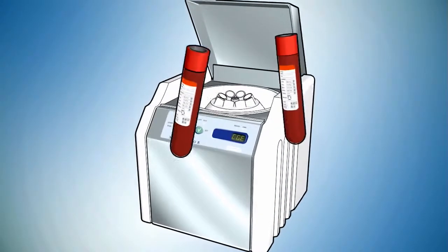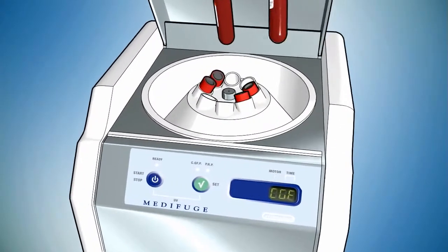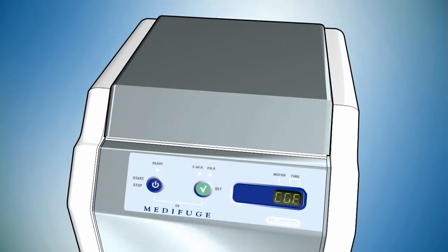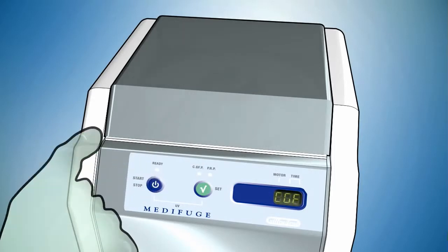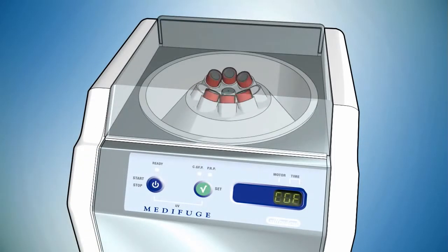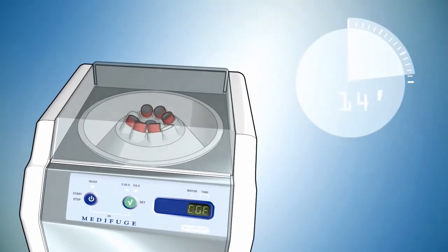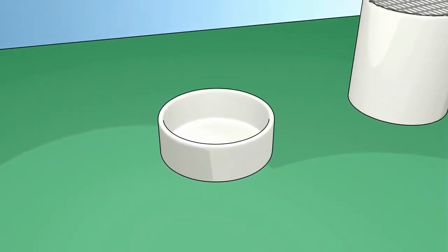Place tubes in pairs on opposite sides of the rotor to allow balancing. Close the cover, set protocol CGF, and press start. The separation takes about 14 minutes. During this time, prepare the sterile table with the necessary instruments and containers into which you will put the CGF.